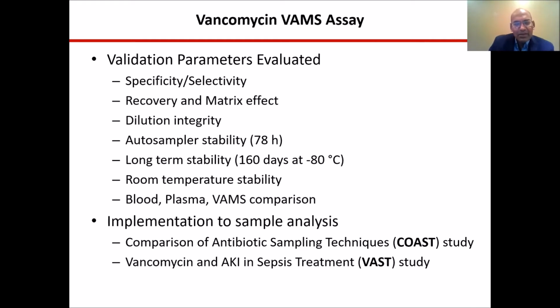And in terms of batching samples for clinical analysis, we established that the samples stored at -80 are stable for over a 5 month period.